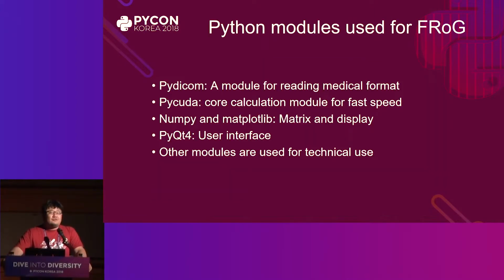So I would like to introduce how I used Python. Here are the modules that I used. One is pydicom. This is the key of the medical analysis.